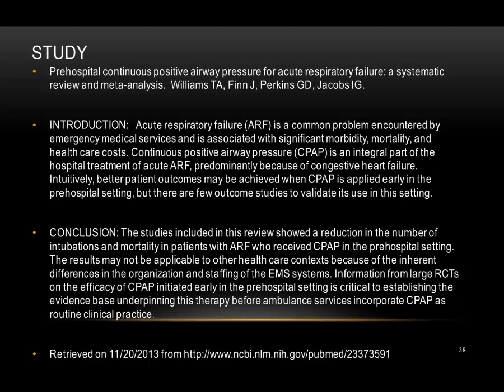Here is a study of CPAP and acute respiratory failure. In this review and meta-analysis study, they found that pre-hospital use of CPAP in acute respiratory failure reduced the number of patients who were intubated and the number of patient deaths.